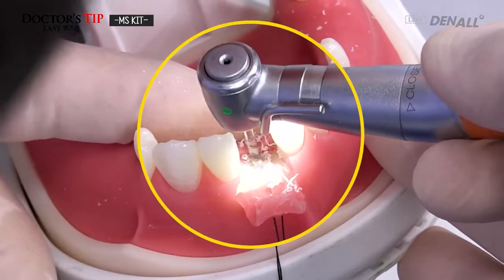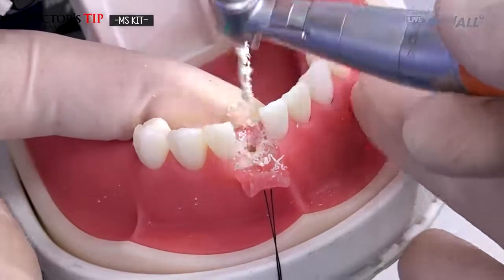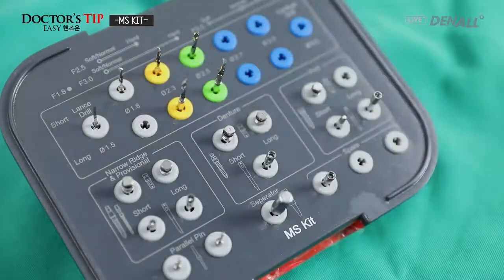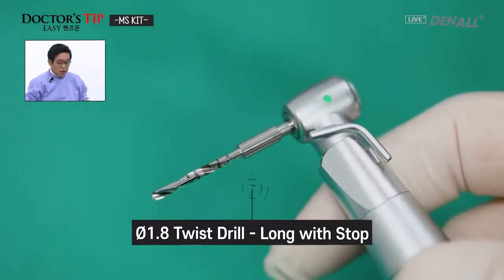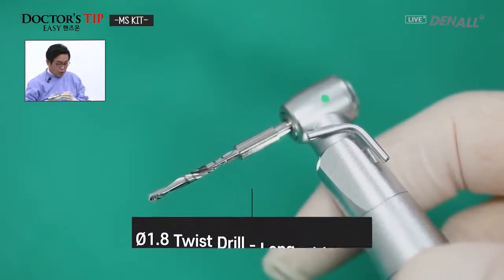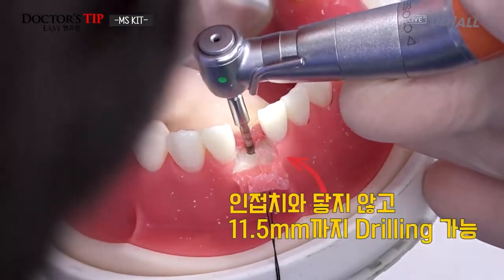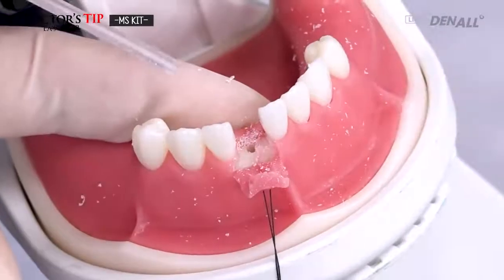If it's the short drill, then there could be interference from adjacent teeth, and if you therefore cannot go to the full length, then you change to the long type, the long shaft drill. Same diameter, use the longer version. So it's a long with stop. And again, because there could be interference in the mandibular anterior, you use the longer version of the drill, sufficient to go up to 11.5 millimeters. So I have drilled up to that level.